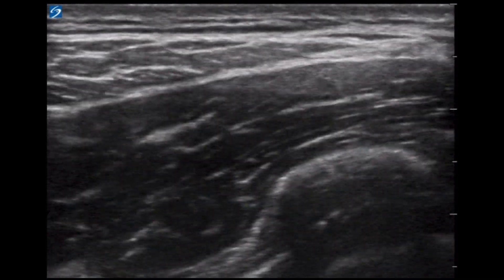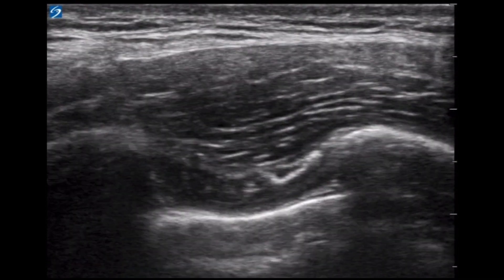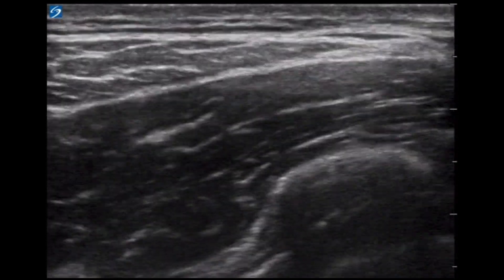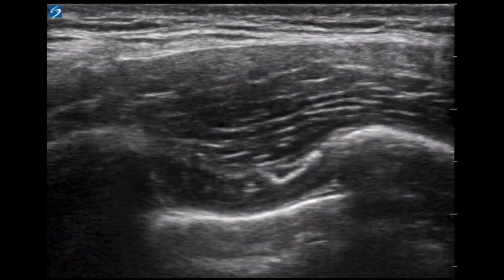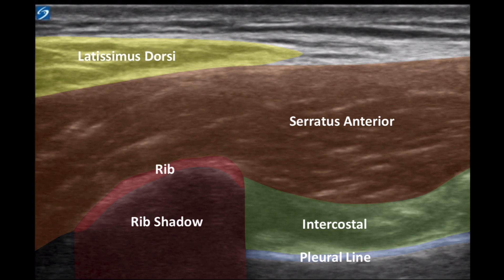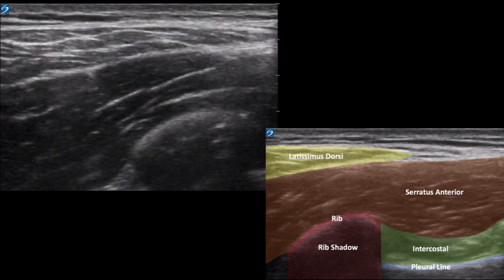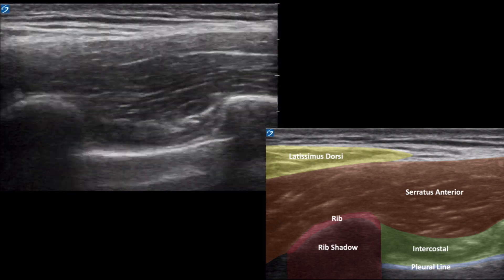The previous video shows the probe overlying the mid-axillary line. The start of this view is a similar depiction, yet slid slightly posterior with the probe to allow visualization of the latissimus to come into view. The anatomy is depicted in this picture — the latissimus dorsi is now seen superficial to the serratus muscle and is highlighted in yellow. Hopefully, these two examples allow clear appreciation of the simplicity of the relevant anatomy to safely perform this block.